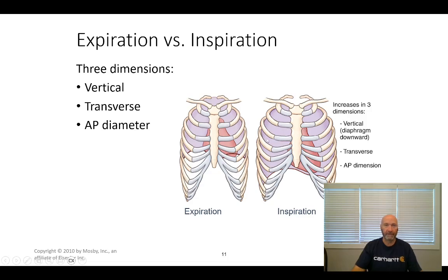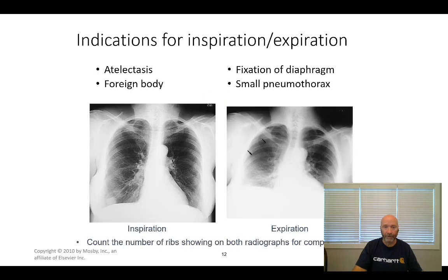So their lungs expand in all dimensions. It seems like their lungs go from their eyebrows to their kneecaps. So in my experience, the hardest people to get on an image receptor, especially when we used a 14x17 image receptor, the hardest patients to get on were people with runner's build. Hyposthenic patients, they're athletic, but they have a runner or a swimmer's build.